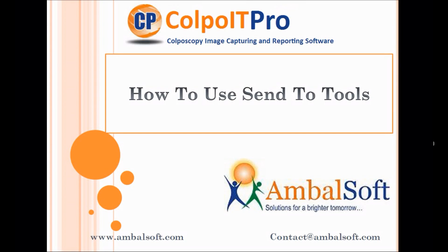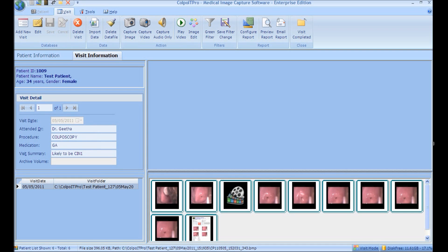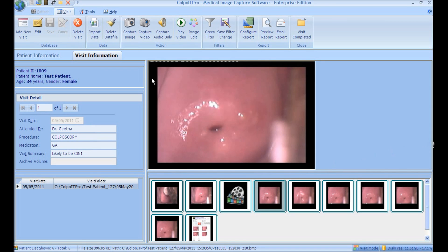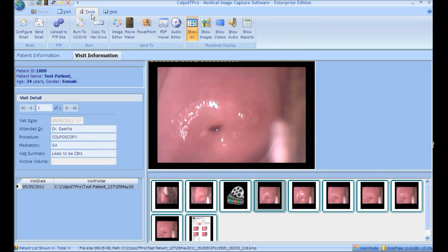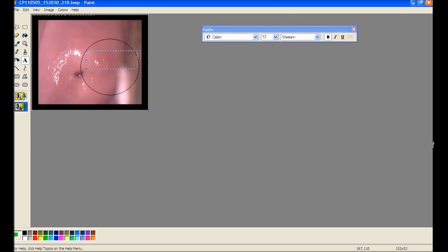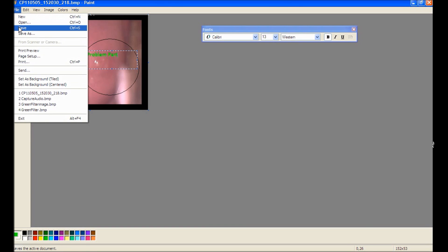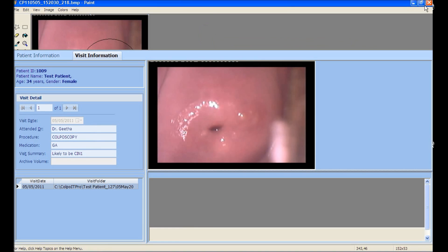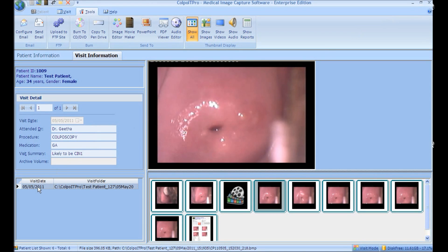Colpo IT Pro provides a set of easy utility tools. Image Editor: to edit the selected image, click Image Editor. The application is integrated with Paint, but can also be integrated with other image editors like Photoshop. It helps in adding comments or arrow marks. Once the necessary marking is done, click Save and refresh the visit folder to see the edited image in the thumbnail.